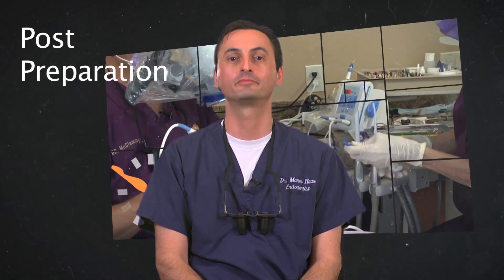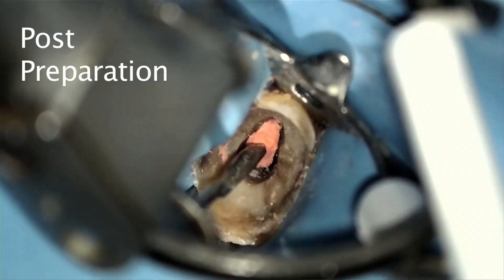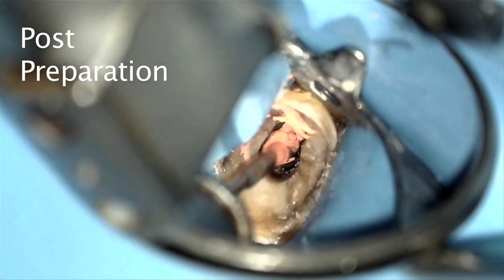Third, I'll speak about post preparation. Preparing a post space in canals obturated with gutta core is quite easy. Simply wait about 30 seconds or so to allow the gutta core to set, and then you may use nearly any drill you wish to make your post space. This could be done the same way as you would with plain gutta percha obturations. I found that you don't necessarily need special post space drills for gutta core — I can't say the same with other carrier-based obturations, however.